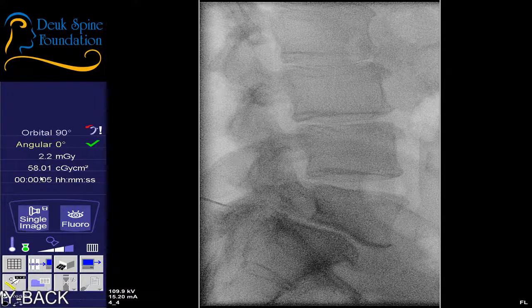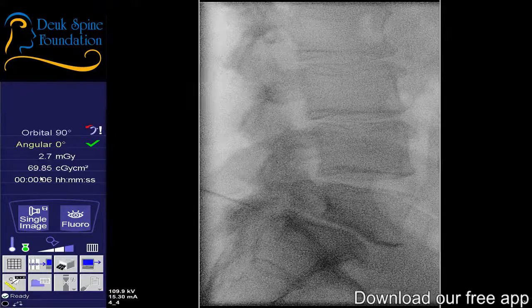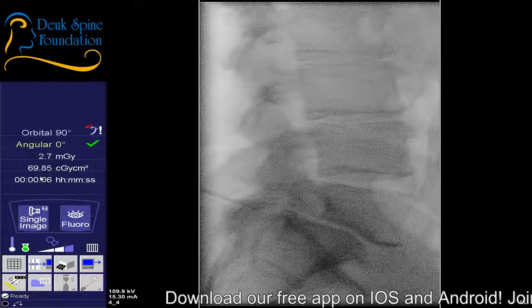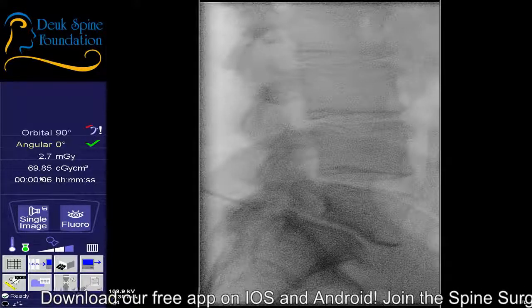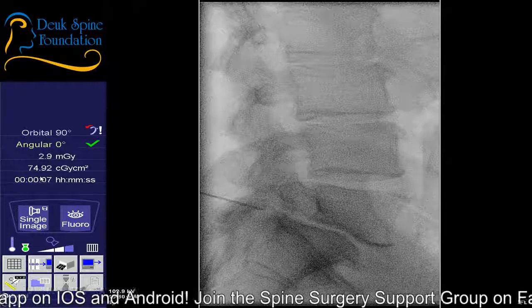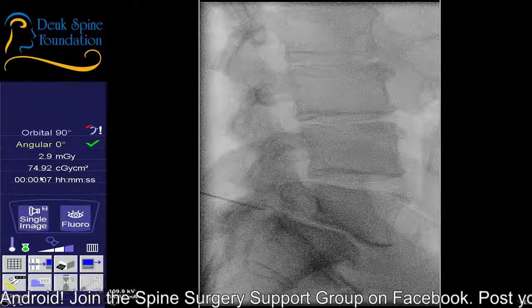Are you comfortable? About as comfortable as you can be, right? Laying on an operating table. Shot. So you can see the needles coming in. And I'm not fixing his spondylolisthesis. We're only fixing the source of the pain, which is not the listhesis. Most people that have pain in their back, it's coming from a disc problem. Shot. I believe his pain is coming from his disc. And the disc just happens to be where there's a listhesis. Shot.